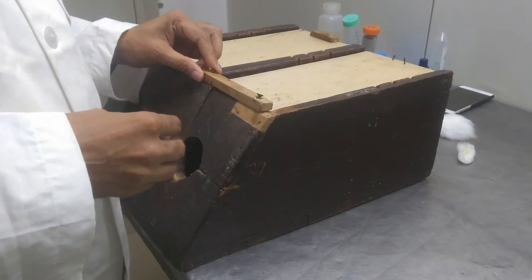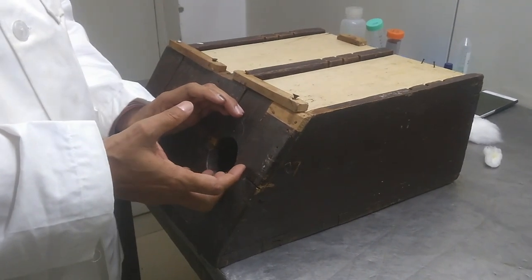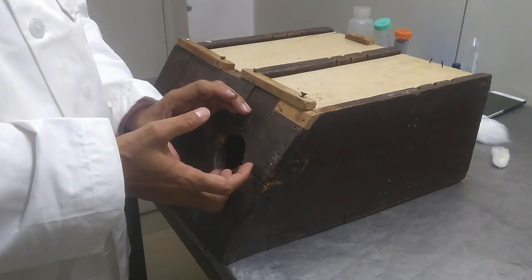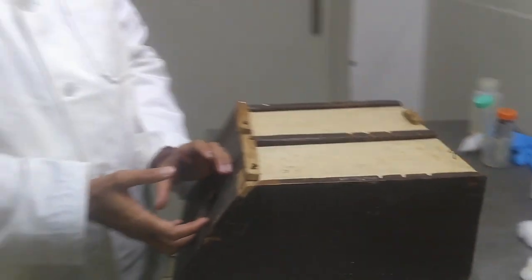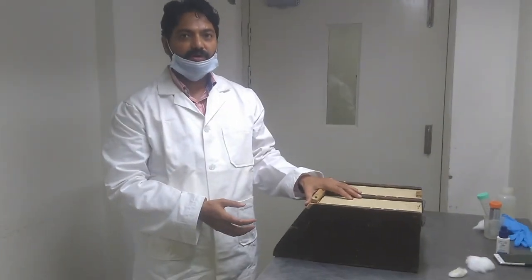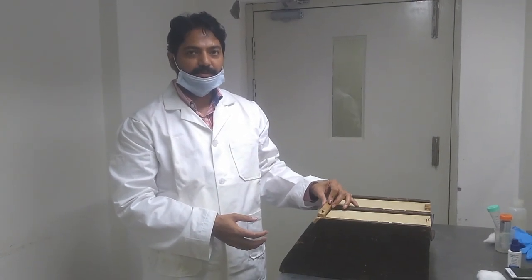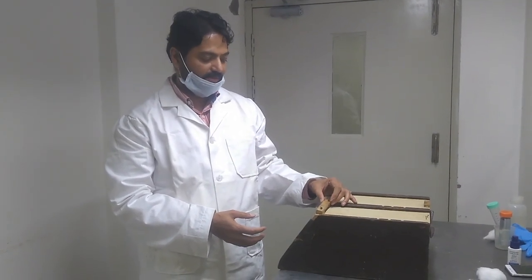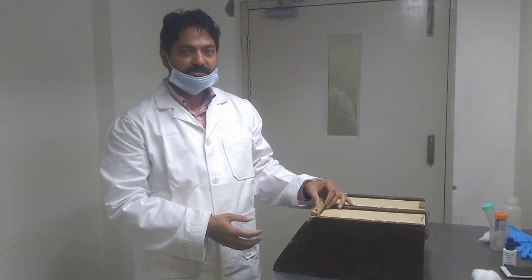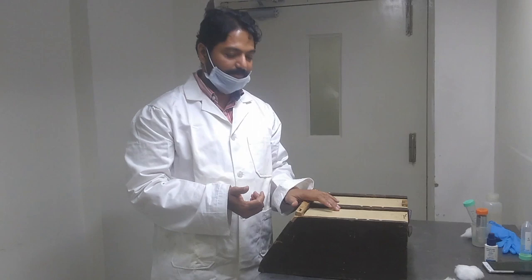The neck region, and the animal is ready with his head out and the ears outside from where we have to bleed. But the drawback of this strainer is that if the rabbit is smaller, or depending upon its behavior, if it panics, sometimes it rotates itself and the backbone is broken.